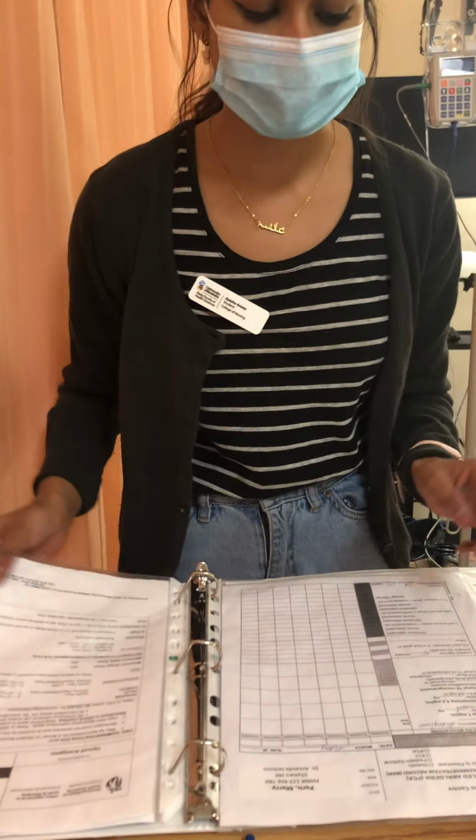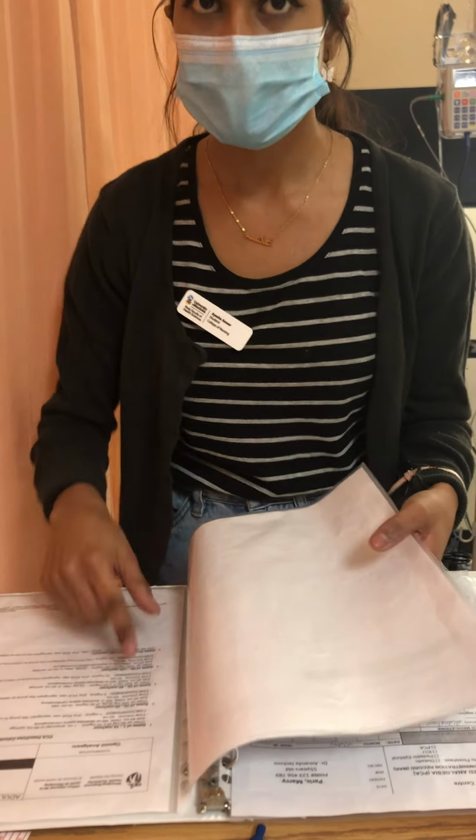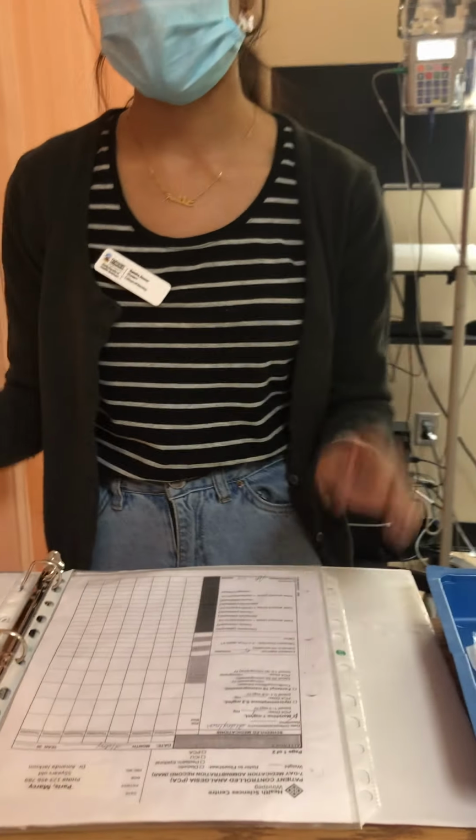So we have the right dose. The right route is PCA. I have the PCA MAR, I have the PCA section of the PDM, and the right time is now, today. So I've done my first check.